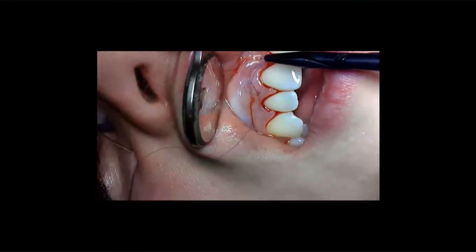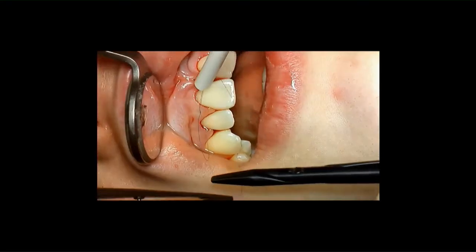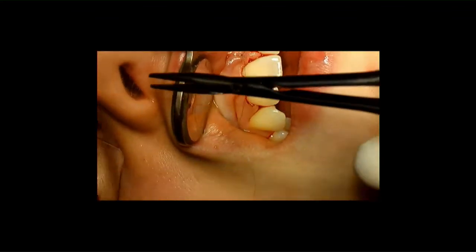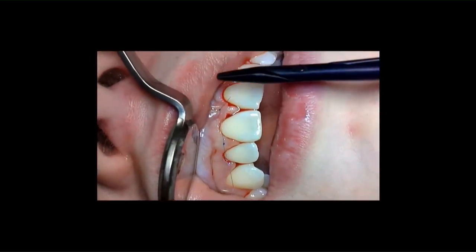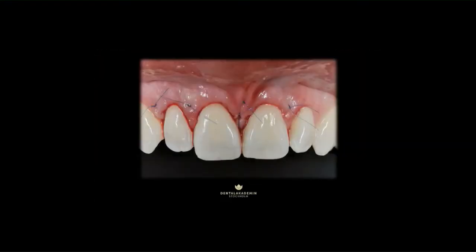Always, of course, a little bit nervous or anxious to see if all the papillas will fill the interproximal space. And as you see in this case, at suture removal, it doesn't. But a few months later, it sure does. Okay, I think we can stop the movie there.